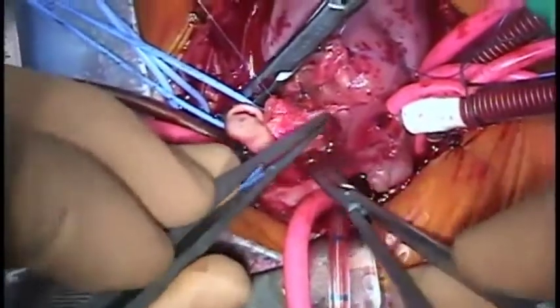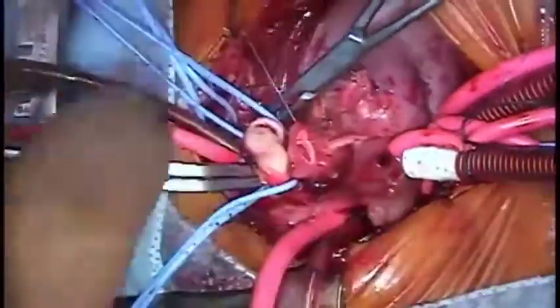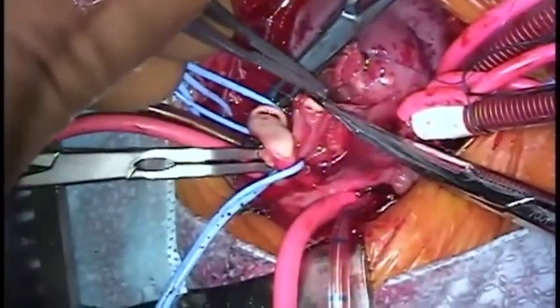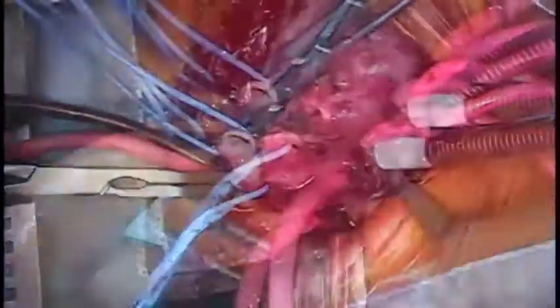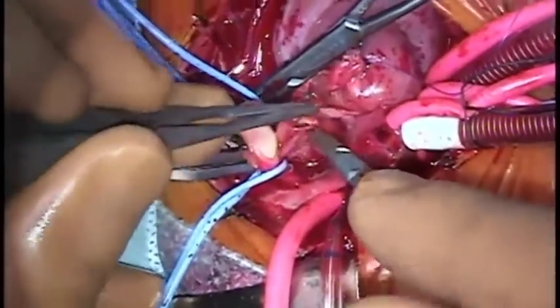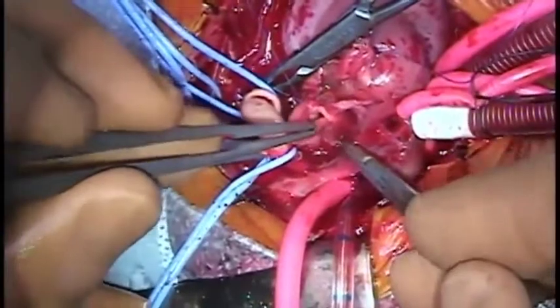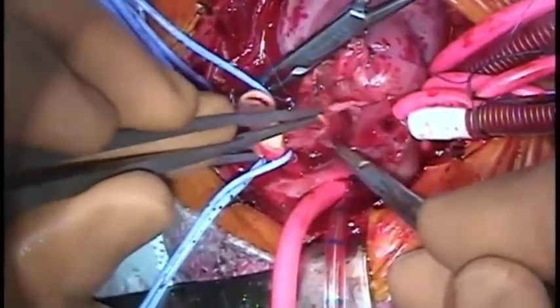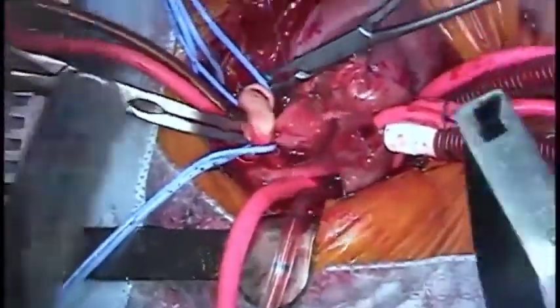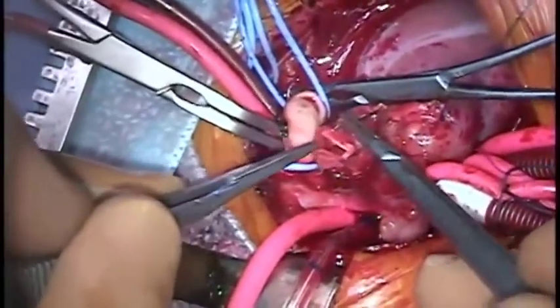As the suture line passes the right coronary, the two stitches are tied together. Here the tip of the right coronary button is being trimmed to conform to the shape of the patch. The suture line is continued, again switching from right to left to balance the shape of the anastomosis.